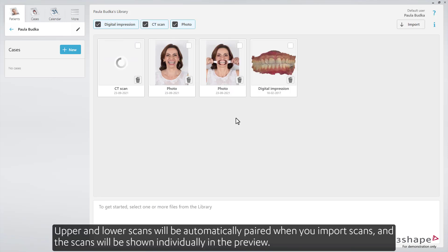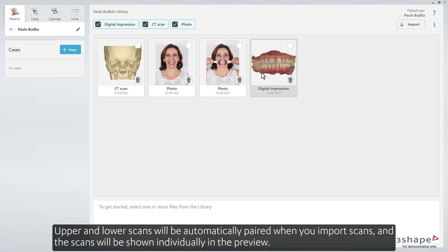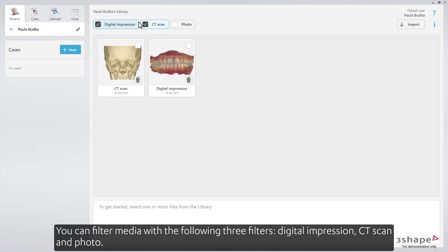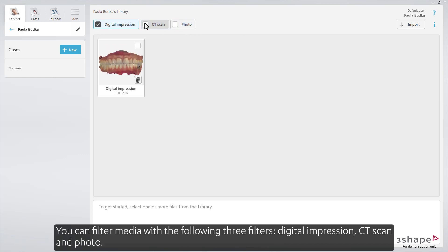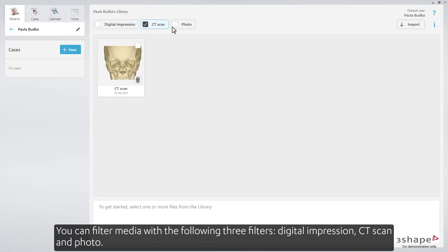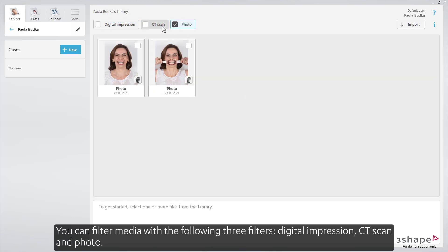Upper and lower scans will be automatically paired when you import scans, and the scans will be shown individually in the preview. You can filter media with the following three filters: digital impression, CT scan, and photo.